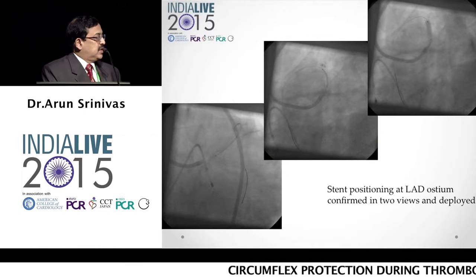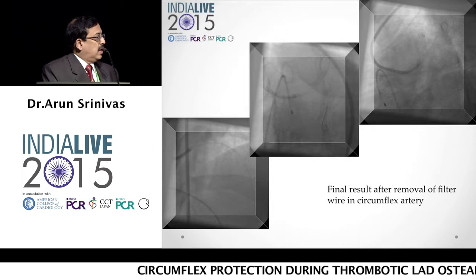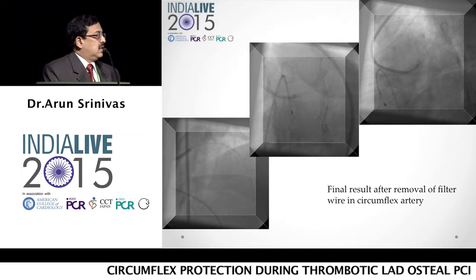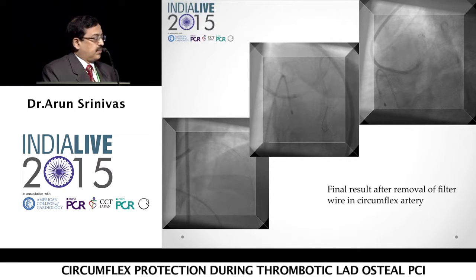A stent was positioned into the ostium of the LAD artery, confirmed in 2 views, and this is the stent deployment. And the final result after stent deployment and removal of the filter wire from the circumflex artery.